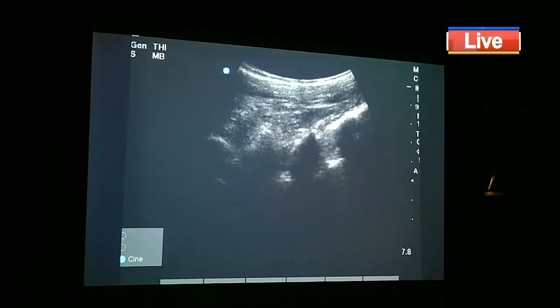Okay, the Tuffier line is inaccurate, that's why you do multiple tries. But since you are so experienced, you do 5 spinals a day every day, so you get that knack of it. But if you want complete accuracy, I can calculate how much will be the distance. This is actually the anterior one, so the posterior one is here from where this black thing is starting. Okay, I can just do panning and maybe improve this, and you see how much distance is there. It will be shown in just a minute.